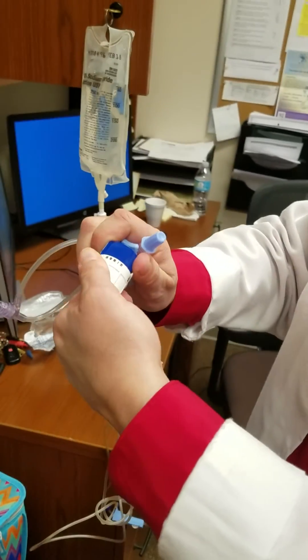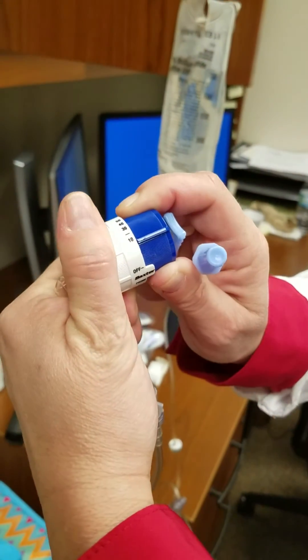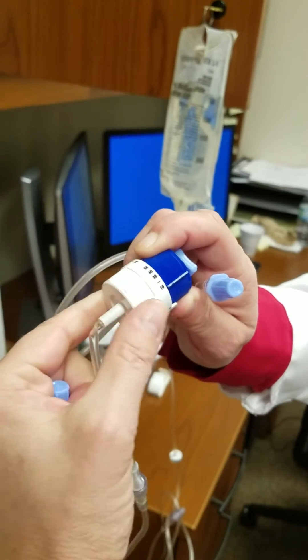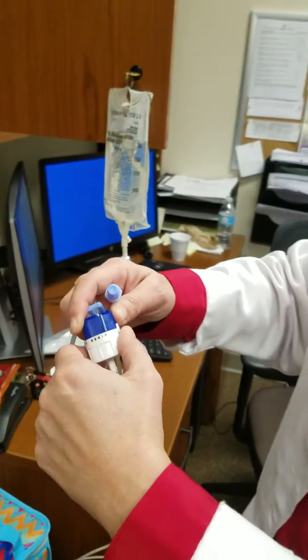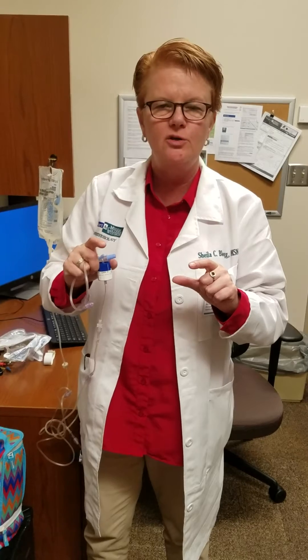It goes all the way down to one to ten, all the way up to 250 ml. Now it's very important to understand you're not going to be able to calculate your presser medications. So the organization would like you to have a sheet of paper that has your presser rate and ml per hour.